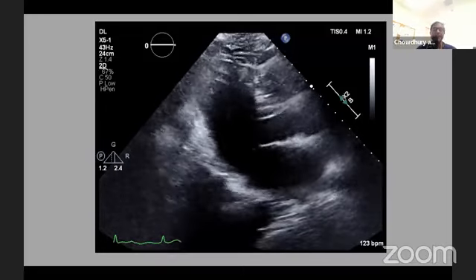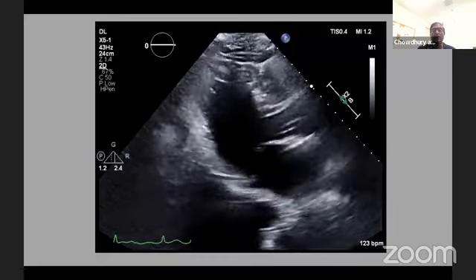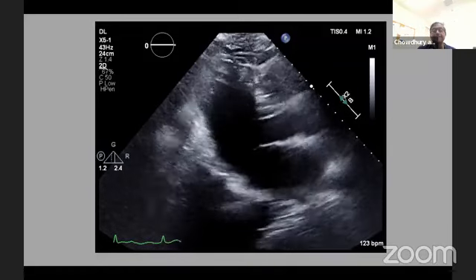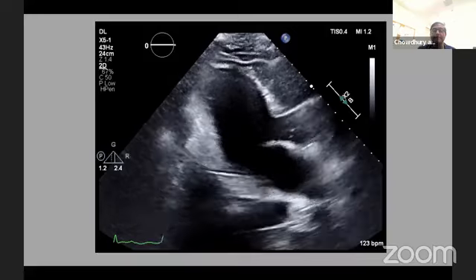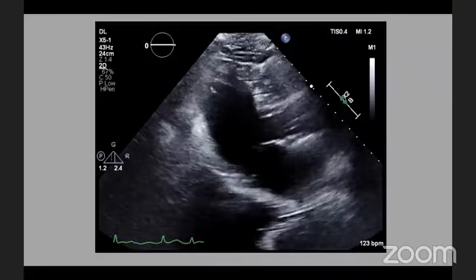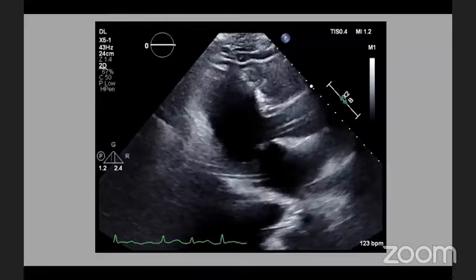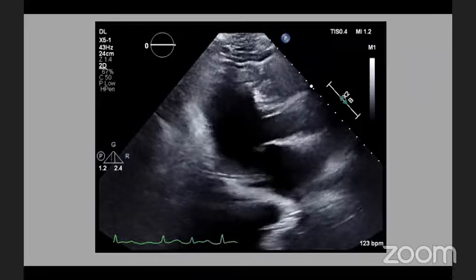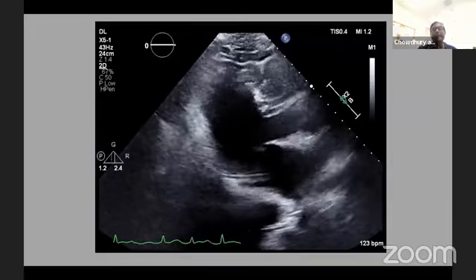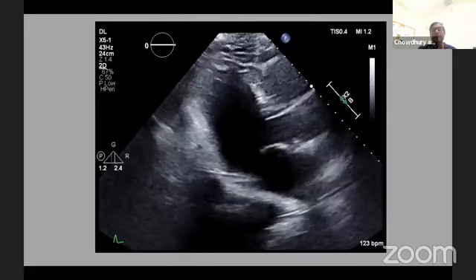But this is the echo, bedside, on the way to the cath lab. What do you think? Infarct artery. Anyone? It might be LAD. Which one? It's a long axis mid segment of LAD most likely, but you can see the short axis. No. Look at the anterior wall. Anterior wall thickens. Even the apex moves. The inferior wall is the problem, right?